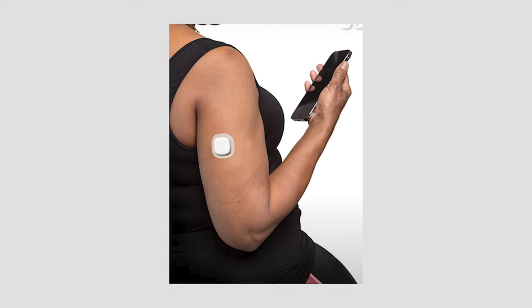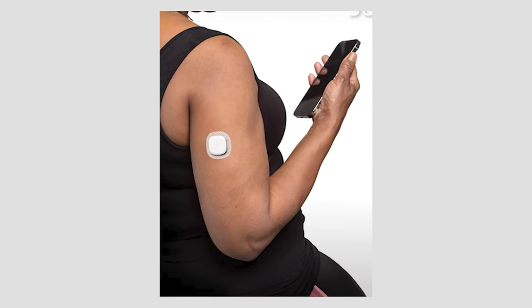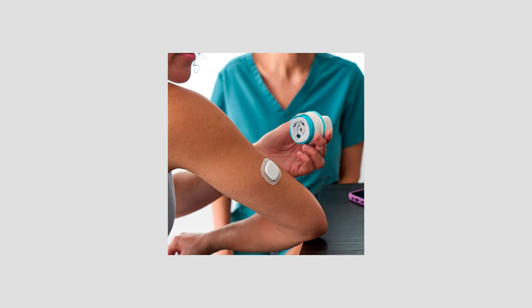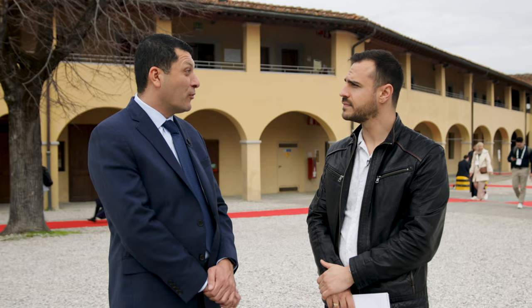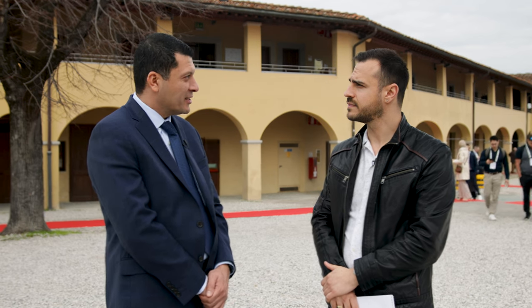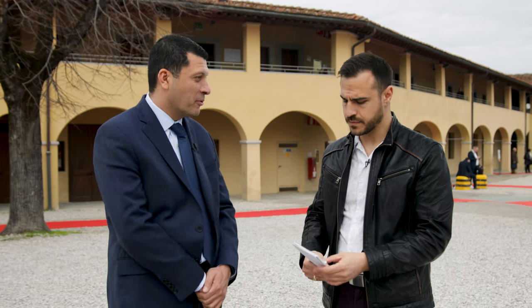The simplest thing to explain is it no longer has a separate transmitter — it's all in one. So it's fully disposable and super easy to put on the body. Less than 10 seconds and someone can have it on. No need for overtape, and no need for charging or cleaning. The intent of Simplera is to be just that — very simple.